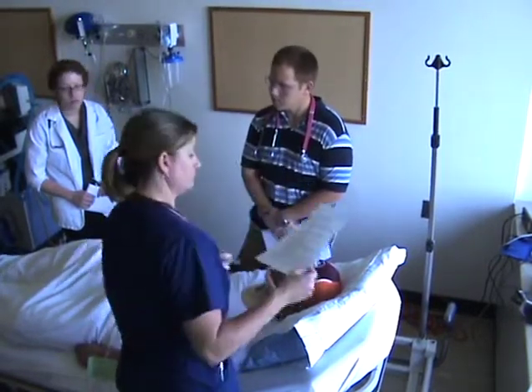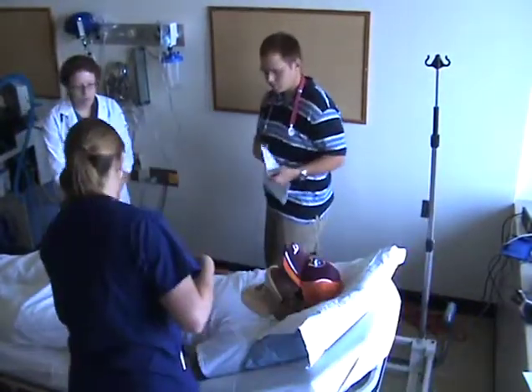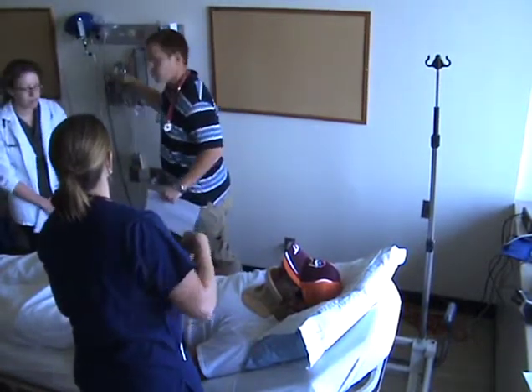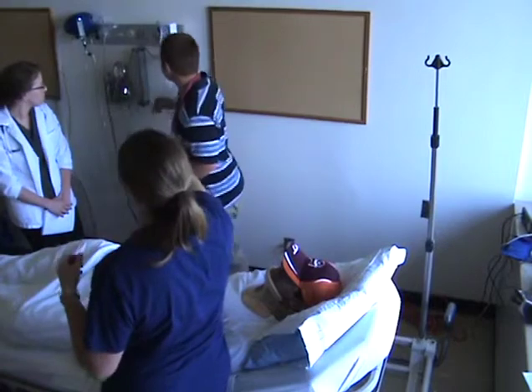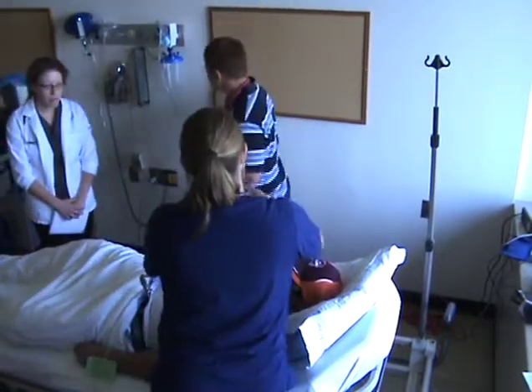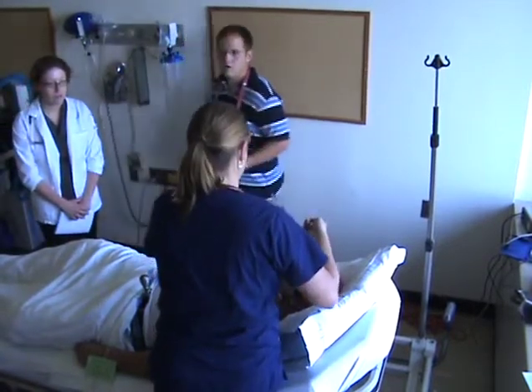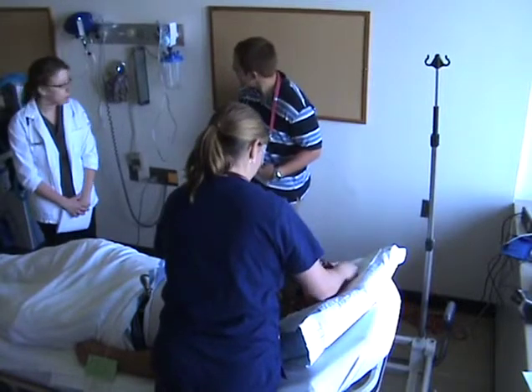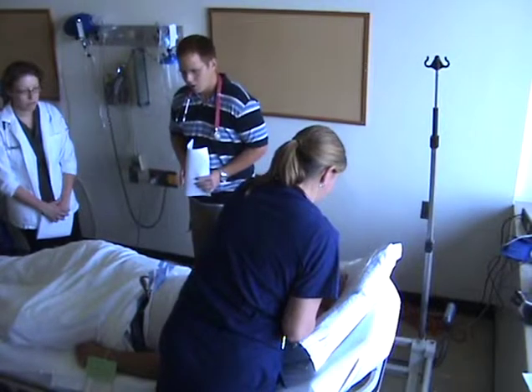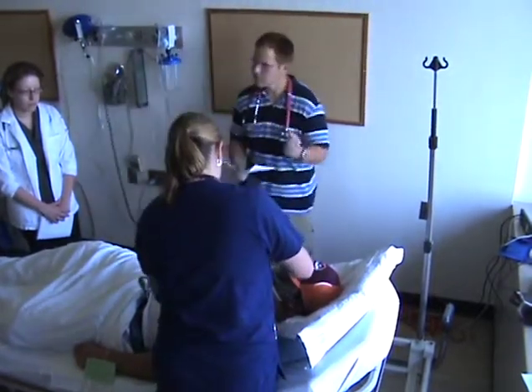Okay. So he's going into distress. His color is not good. It's dusky, and we need to set up for intubation. Well, give me the non-rebreather and then we'll set up for intubation. Anything else you want to check with breathing at this point? O2 sat. Okay, we can hook that up. We have an O2 sat monitor.